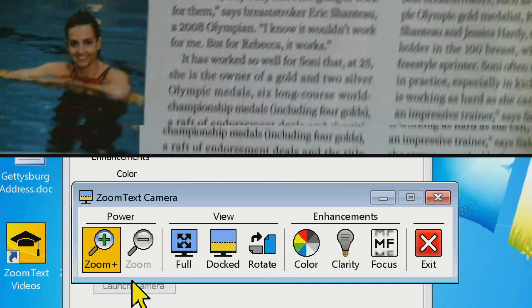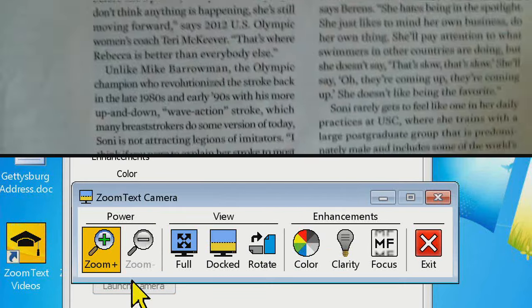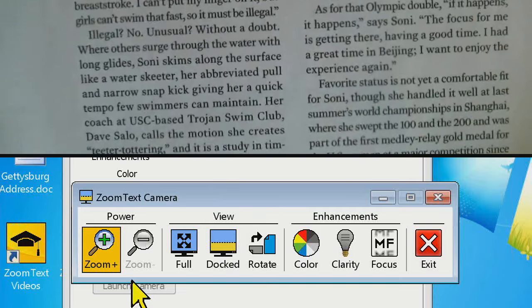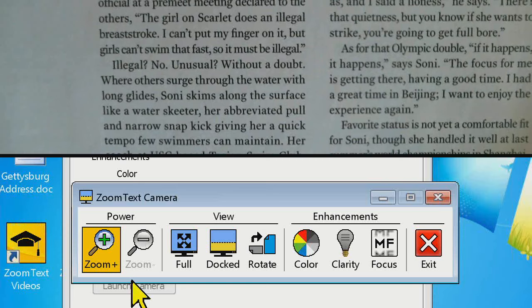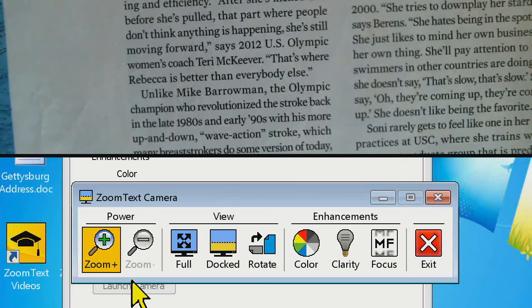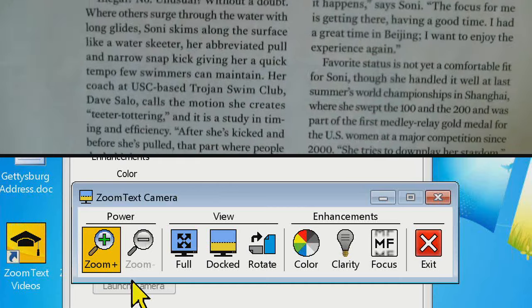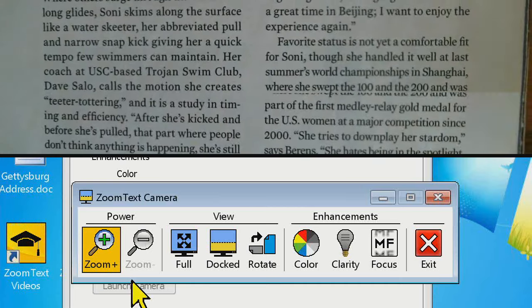Camera horizontal split. Notice as I'm moving the magazine under the camera, it's not very fast, kind of slow. Okay, so right now this is at 10 frames per second. Most people's eyes can see about 30 frames per second. Television, for example, usually is about 30 frames per second. Movies are 24. So that's what our eyes are used to looking at. So something like 10 frames per second is going to look really choppy.